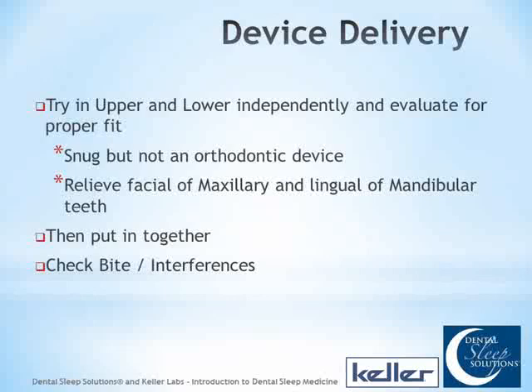One of the things I'd like to add, I don't think you mentioned, is with the EMA device in particular, you want to deliver that device with the #1 white bands. Those are the longest and most flexible bands, and initially delivering it with one band on each side, the white #1s are the ones you want to start with.